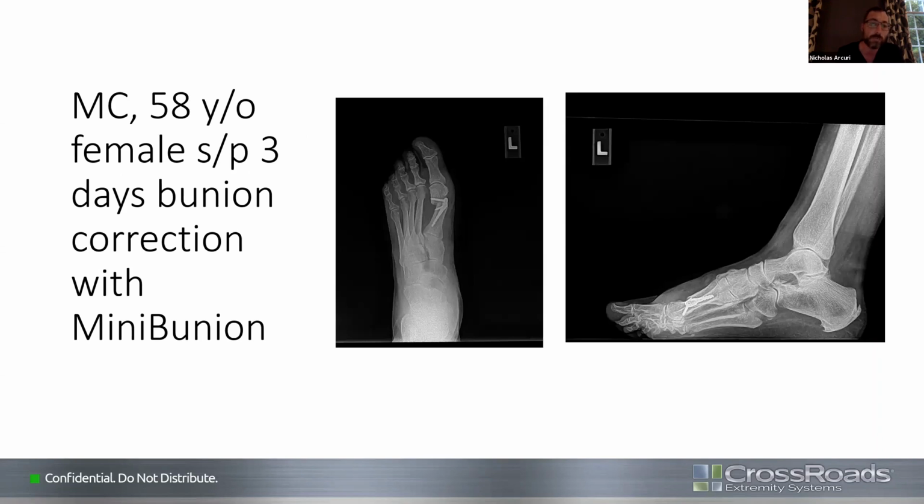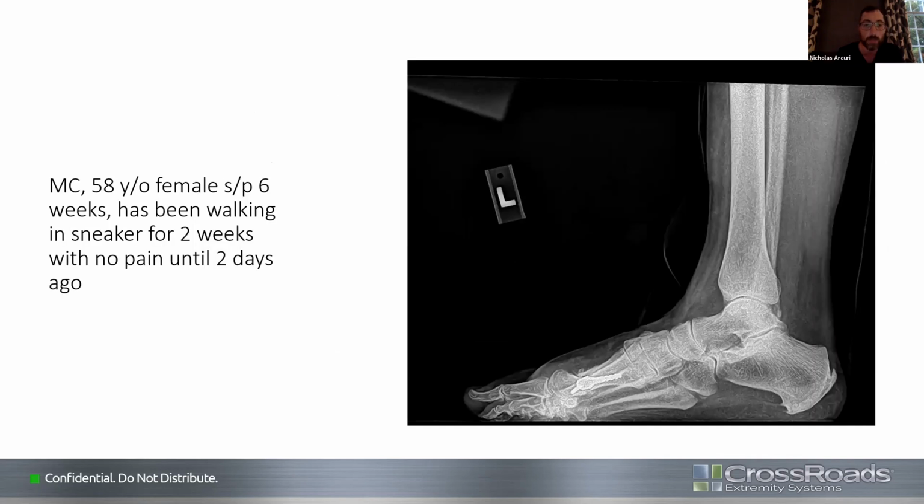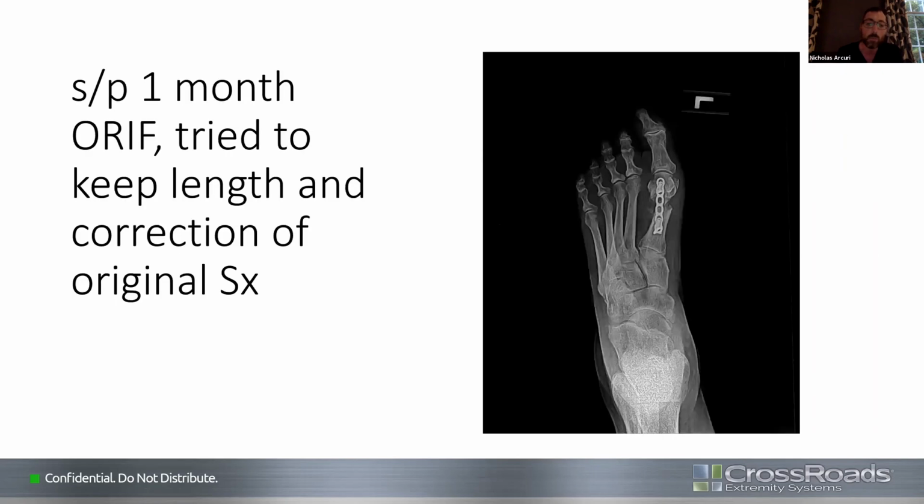My second case was a 58-year-old female. This is status post 3 days. Her AP is in a very supinated position, but she was doing well overall with very little swelling and pain. She had transferred to a sneaker at 4 weeks and she was looking great. She came into me about week 6 saying she'd been having pain for 2 days. We took images and we could see dorsiflexion of that capital fragment with a little bit of abnormality up on that dorsal cortex. We went in and revised it, and what actually happened is she had a small fracture on the osteotomy site on the medial aspect. If we look at the pre-op and post-surgical x-rays, the oblique screw was in a great position. It was not close to the osteotomy site.